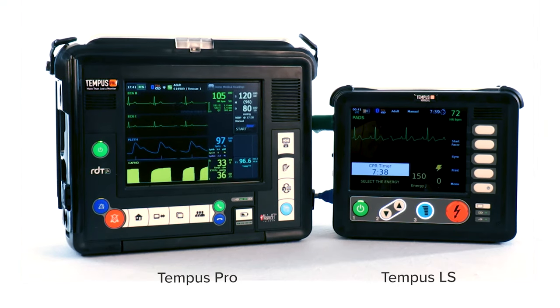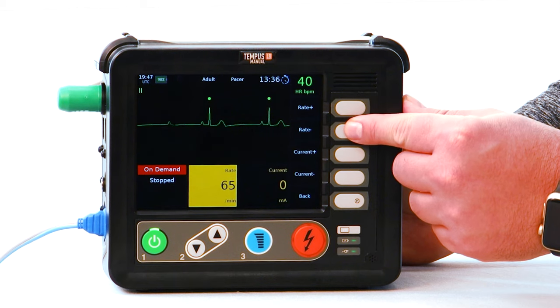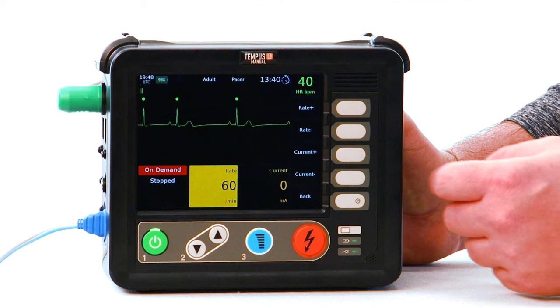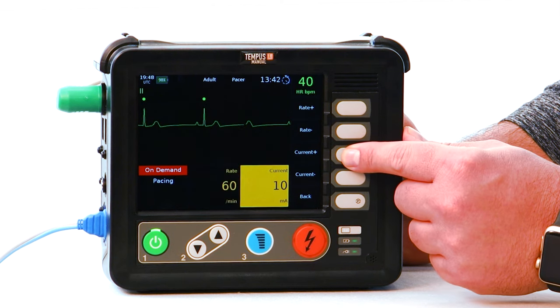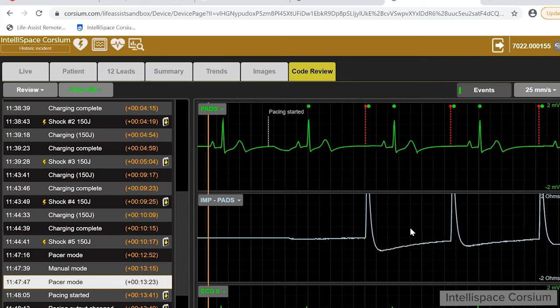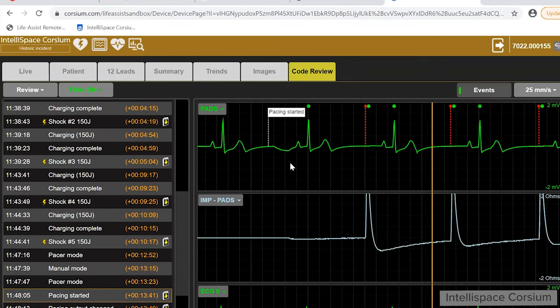The Tempus LS connects wirelessly to its paired Tempus Pro monitor, and every procedure, waveform, and vital sign performed or obtained with this device is available to view in the secure web-based IntelliSpace Corsium platform and can be imported into the ePCR of your choice. IntelliSpace Corsium also offers a robust code review program for your QA and QI department and training.